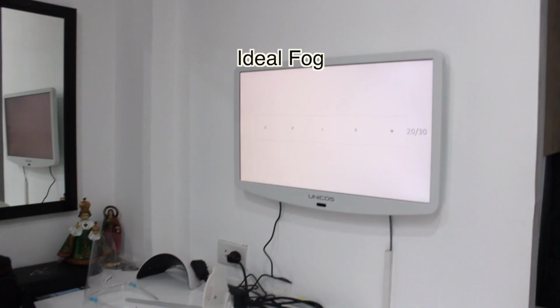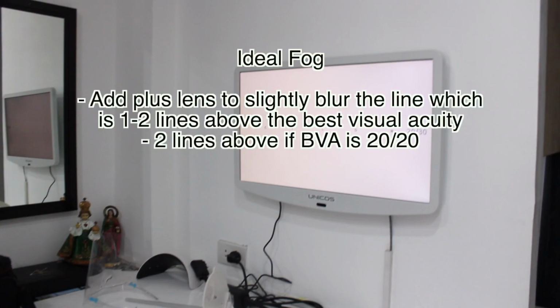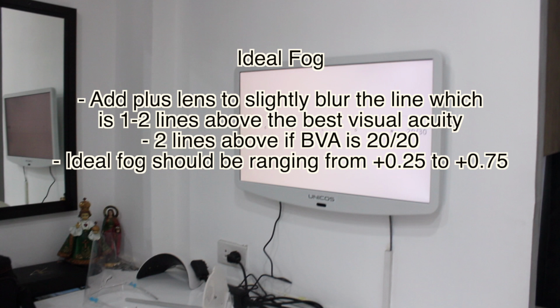Now from this target, tell me if the target becomes slightly blurred. To get the ideal fog, a sufficient amount of plus lens is added to blur one up to two lines above the patient's best visual acuity. Take note that the ideal fog should range from +0.25 up to +0.75 sphere.